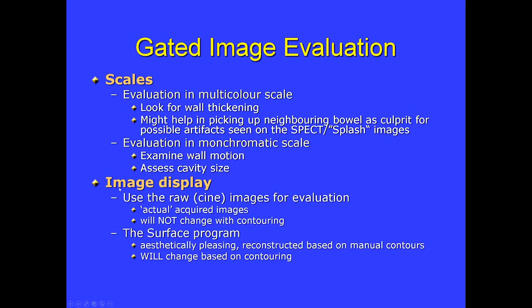So when we are looking at these gated images, again, you can look at them in the multicolor scale, and you can look at them in the monochromatic scale. Again, a suggestion is that you look at both, because the multicolor scale will help you look at wall thickening better.